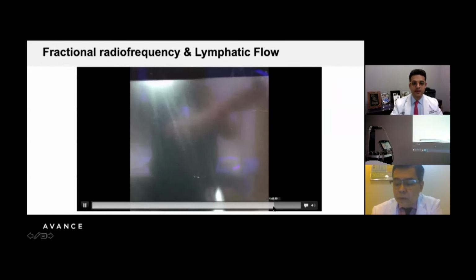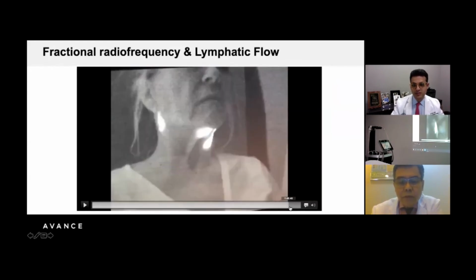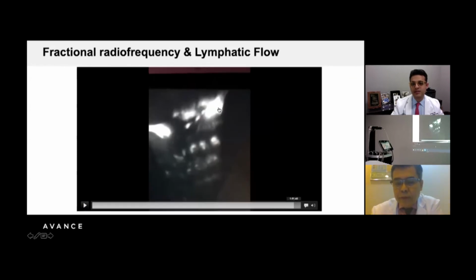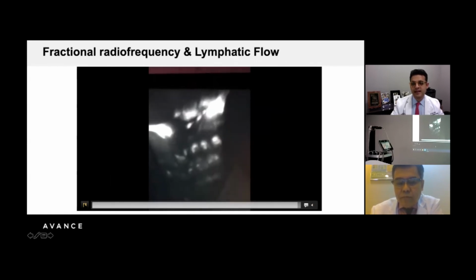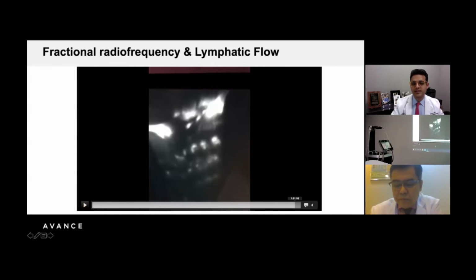And here, this is our microneedling device, which uses bipolar radiofrequency. We injected indocyanine green subdermally, and what it does is map out the lymphatics. You can see this microneedling device actually migrates the dye. If you look closely, you can see the lymphatic channels are maintained. And when you do this treatment in series, it shows increased lymphatic formation.